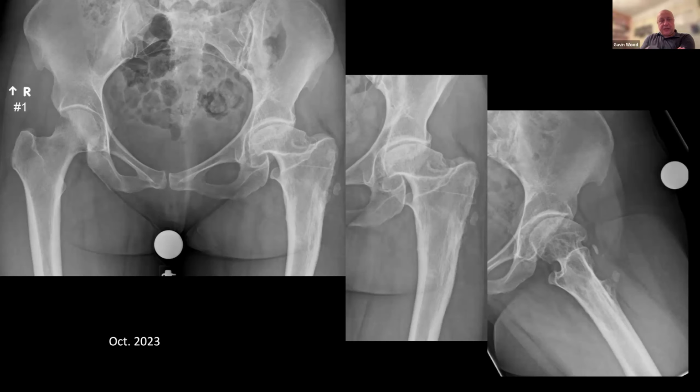And then you have to make the neck cut where a normal neck cut would come out. So sometimes you find you're actually cutting through part of the femoral head while doing your neck cut. But once that's done, you can normally identify the true cortex of the femoral neck, and then you can remove the excess femoral head, which is overlapped down on the neck. She does have a bit of a proximal deformity in that, on the anatomical axis, there's a varus type tilt to the proximal third of the femur.